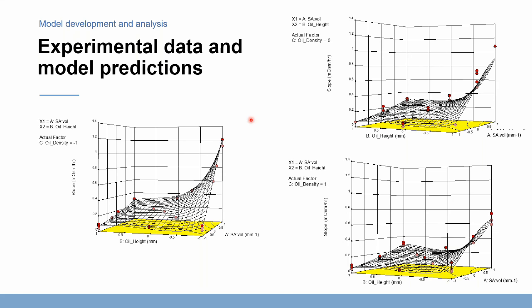And as an additional comment on that from John Davies, he says that functional data analysis is used when the response of interest is a functional form rather than a scalar. It's like principal components, but for responses with curves. Okay.